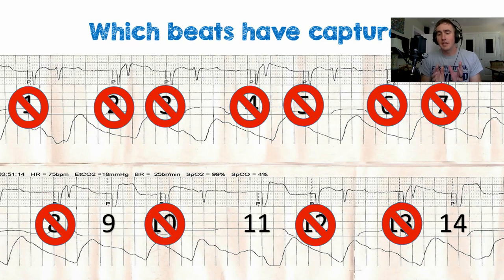Now, I gave this lecture in front of a group of physicians and I asked them the same thing. And one physician got it right off the bat. Only one physician knew which beats had electrical capture and which did not. And I said, that's good job. You did a good job. How did you know? He said, well, I just came from the cath lab where a patient was bradycardic. They started pacing, and that's what it looked like. I said, that's one way to do it.